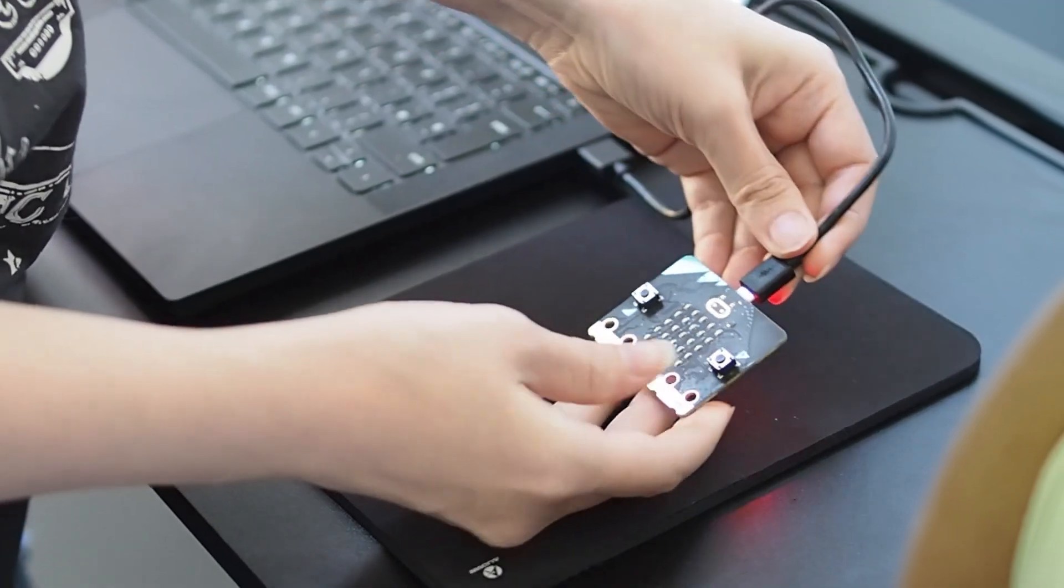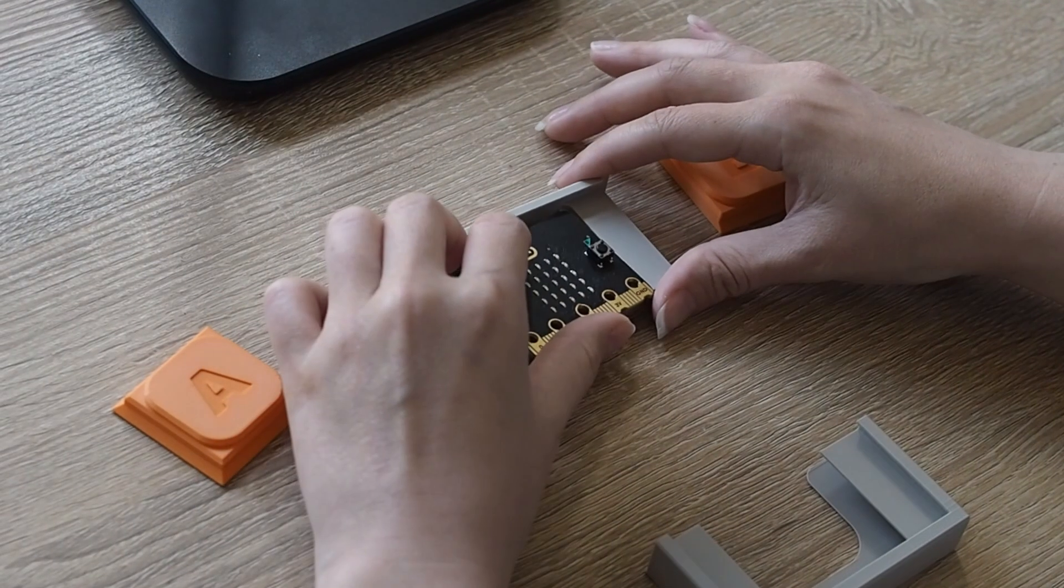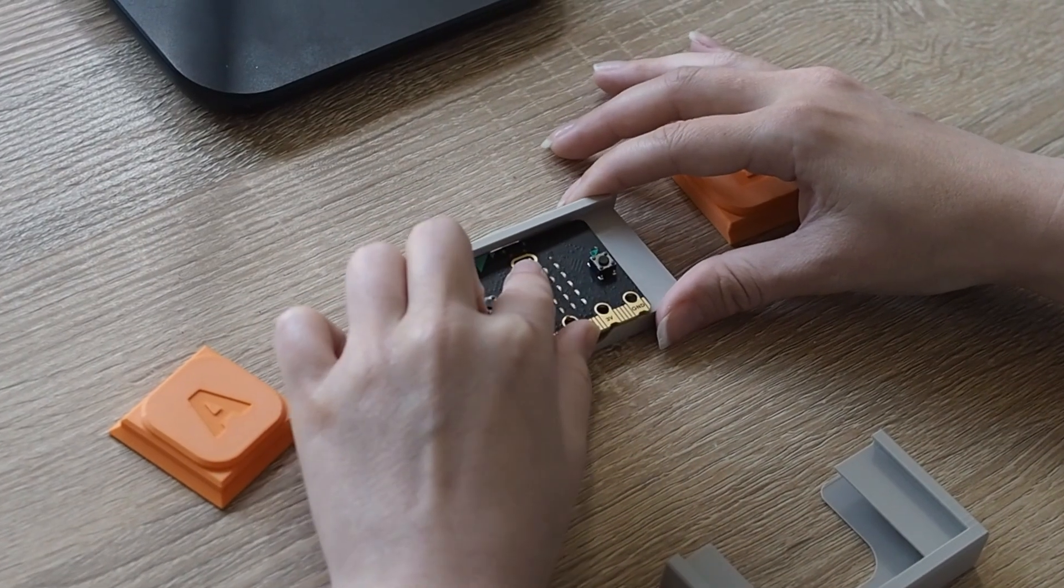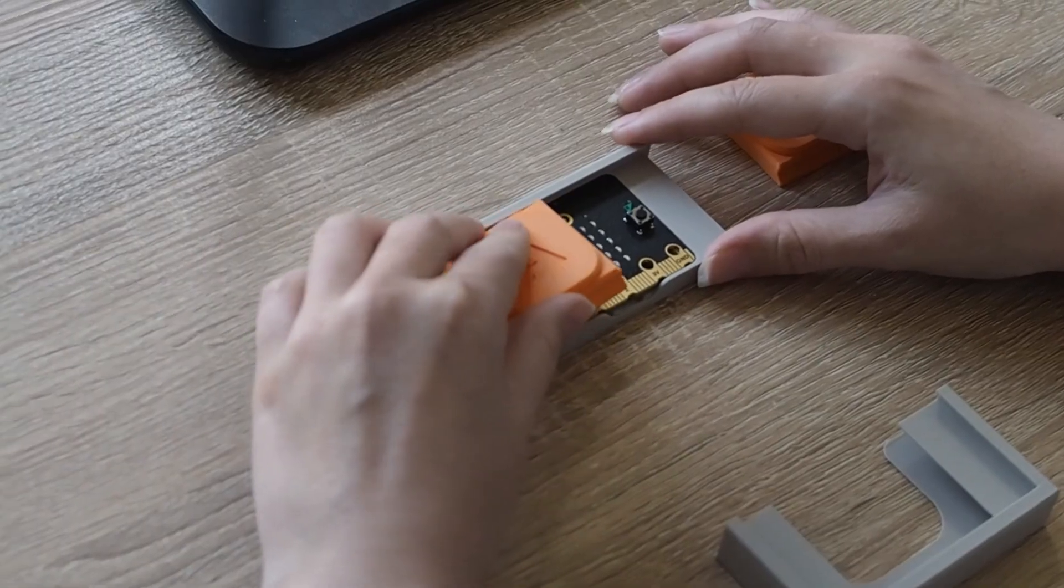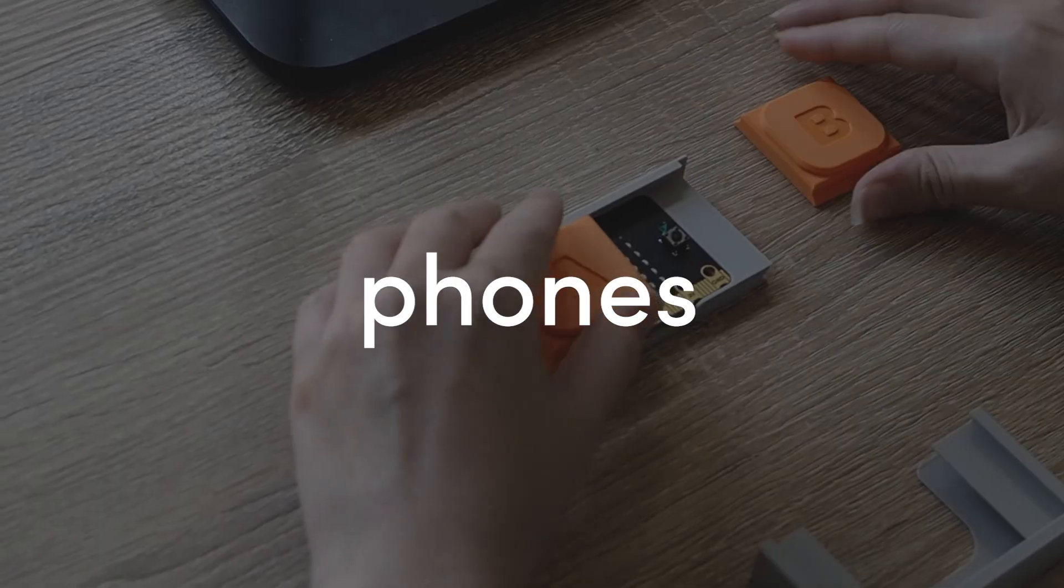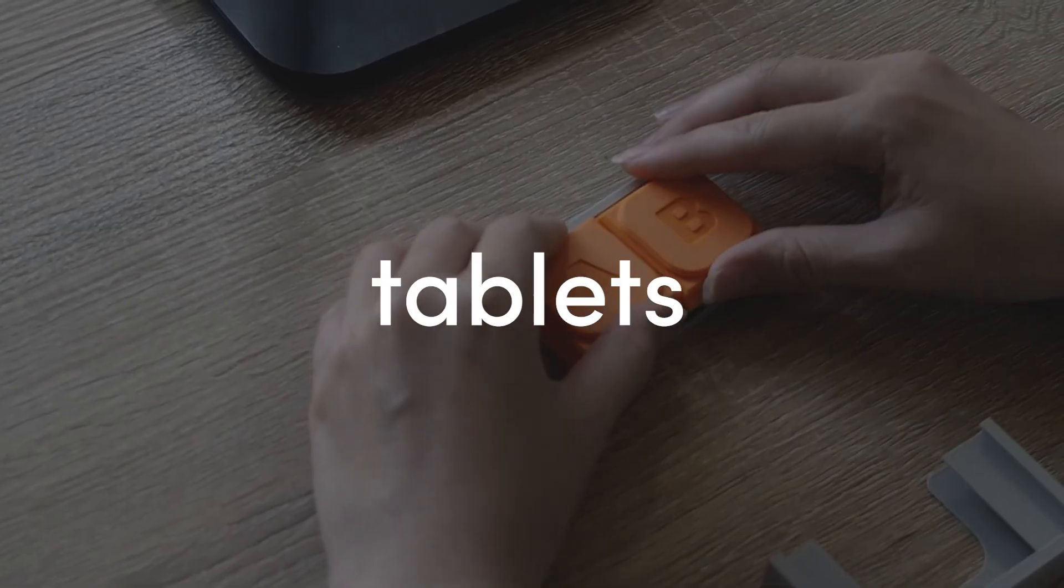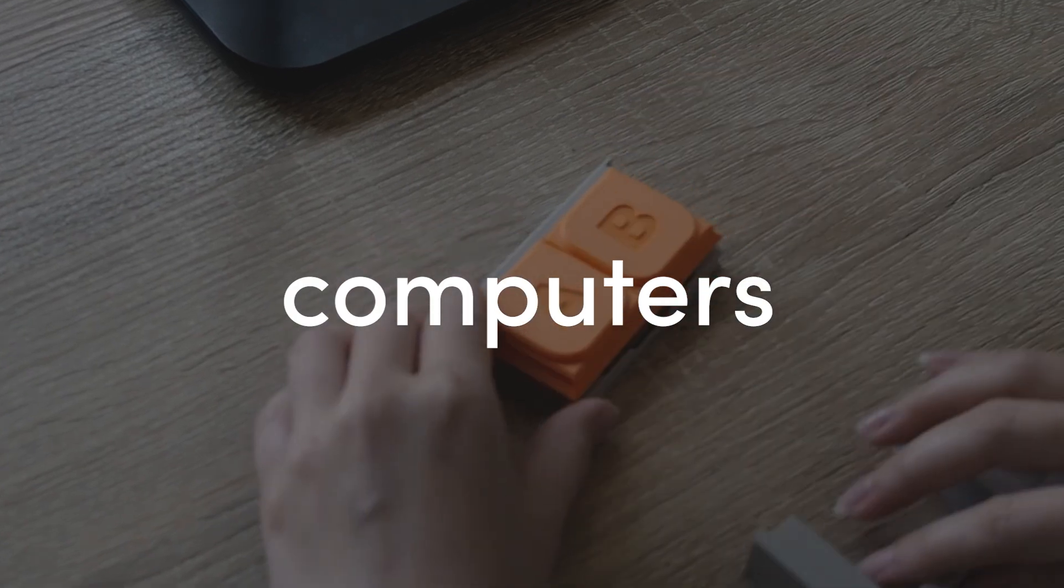TAP is a microbit powered dual switch access device that enables people with disabilities to control mobile phones, tablets, and computers.